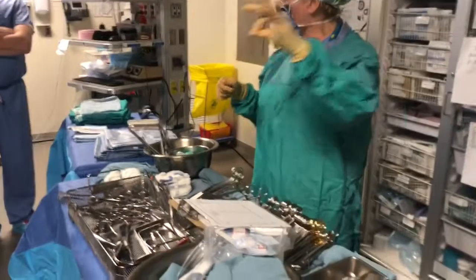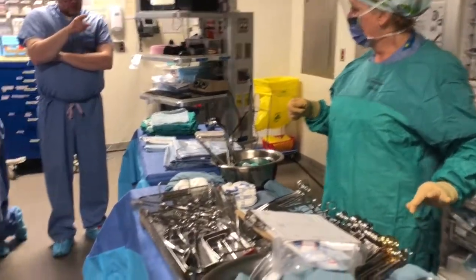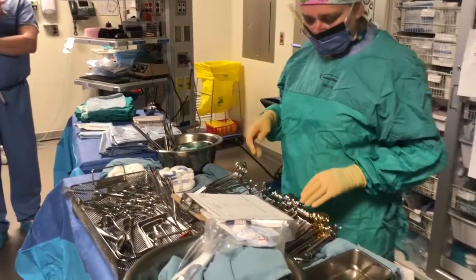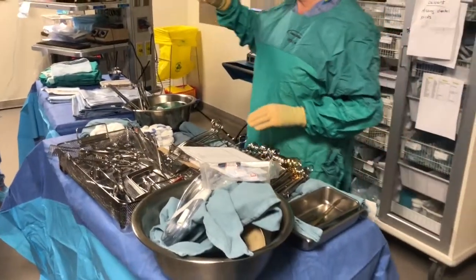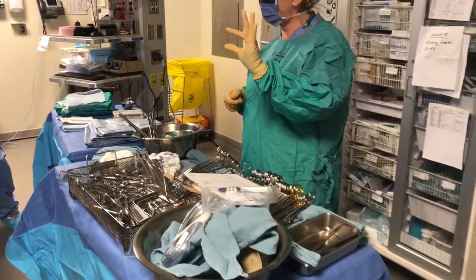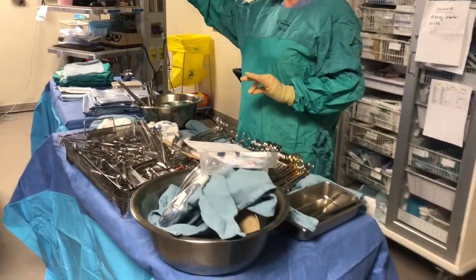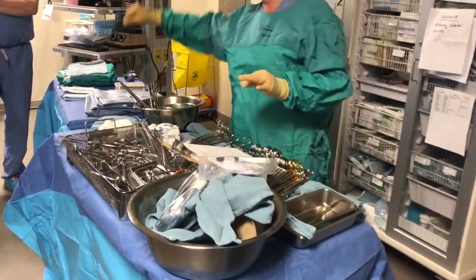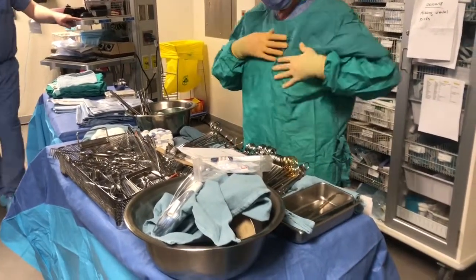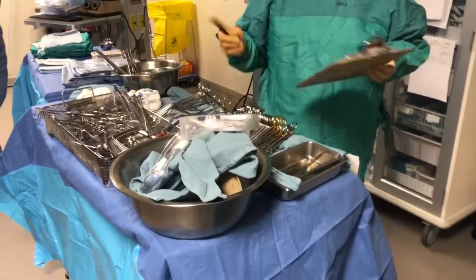What's on the blue? They'll take a Blaylock and put it on the other end. It just weighs it down and pushes it out of the way. It's attached to the suture. No needle drivers? No, they'll have a needle driver on the clip at one end, and on the other end, they'll just put a Blaylock to kind of hold it down. They'll sew and get to a certain spot and they'll take that Blaylock and put it on that one and then transfer it and switch it to the other side.